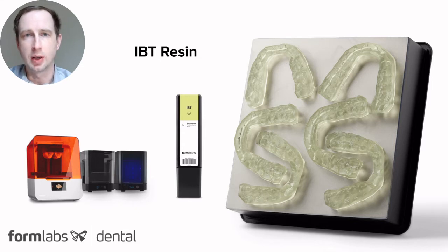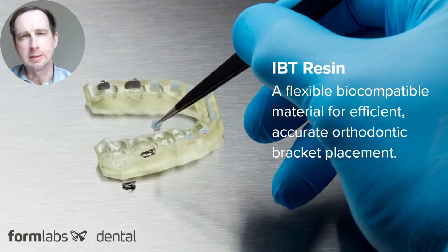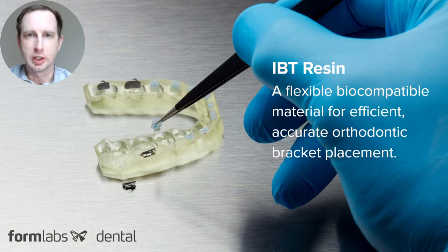IBT Resin was developed and manufactured specifically for the dental industry and used in 3D printing indirect bonding trays. IBT Resin is compatible with our Form 2, Form 3B, and soon the Form 3B-L 3D printers, and also uses our automated Form Wash and curing systems. IBT Resin is a flexible biocompatible material that is accurate and efficient in producing indirect bonding trays for orthodontic bracket placement.